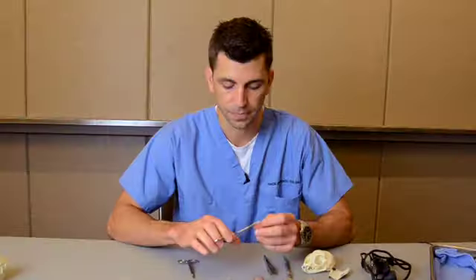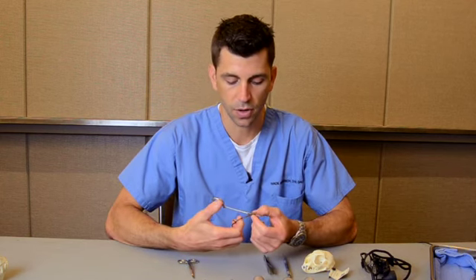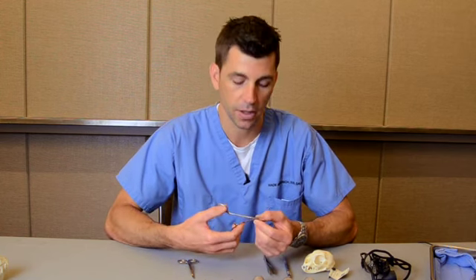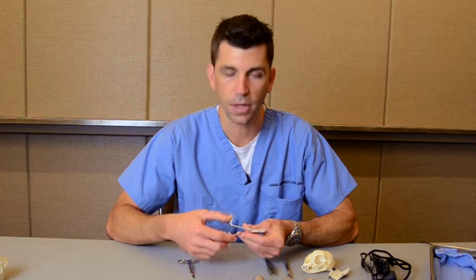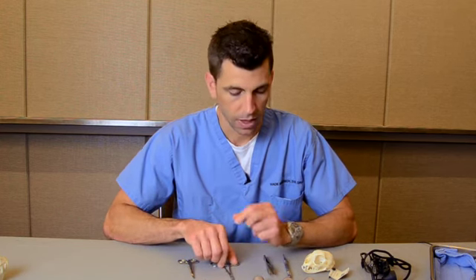I do not prefer the type that has a scissors that's also part of the needle holder, because you can inadvertently cut the suture periodically, and that can be a costly mistake. So this is just your typical Mayo style needle holder, but a very small, fine tip. I think if you use these instruments, you'll find that you're going to reduce some of your complications and frustrations that you have in feline dental extractions.